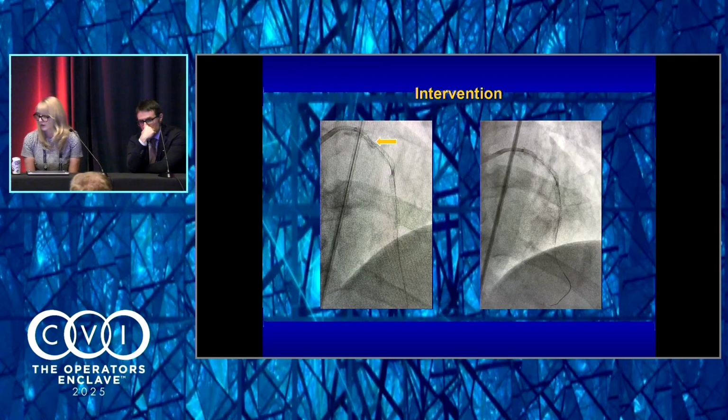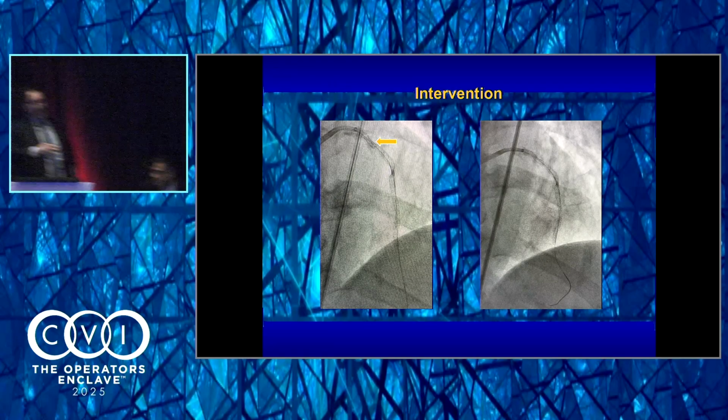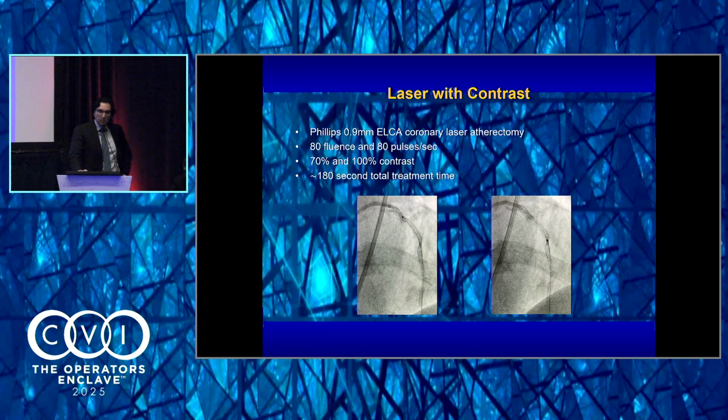And one thing to remember always in these cases, the first thing is check your wires actually didn't go under a stent strut, right? So always try to wire with a loop, because sometimes the wire goes under the struts, and that's why you cannot deliver. No, absolutely. And I tried all those things that I learned from Dr. Balakis' books, but I couldn't get anything across. So I went with a laser.